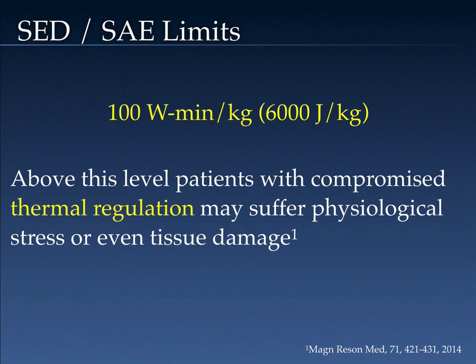So patients who are compromised in their ability to tolerate a thermal challenge, as we previously discussed, it may warrant limiting the amount of time that we spend scanning these patients because of the theoretical possibility of the physiologic stress or even tissue damage.